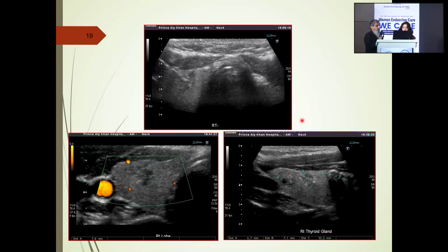Next is again a similar thing. In this scenario, these look almost innocuous nodules, but this patient had an abnormal nodule which was mistaken as lymphangioma. The nodules can be so cystic that they are almost mistaken as not related to thyroid, but the aspirate showed that it is from thyroid. Then you go back to the smallest nodule, which is less than 5 or 6 millimeters, and you still want to do FNAC because you need a tissue diagnosis. So this is the importance of overruling the size criteria and coming back here.